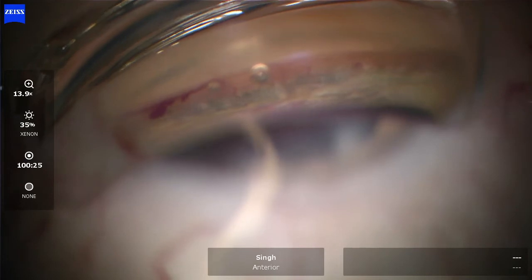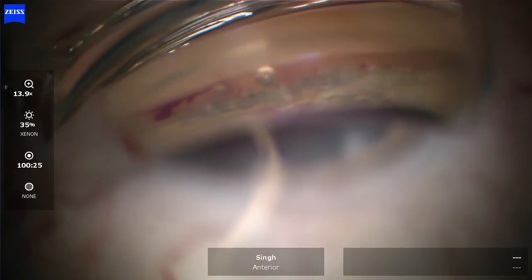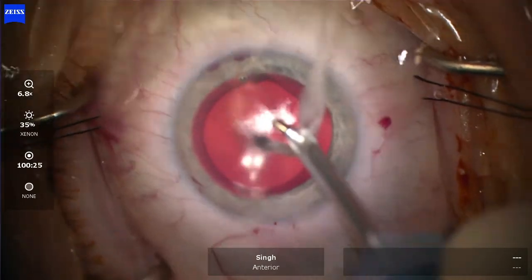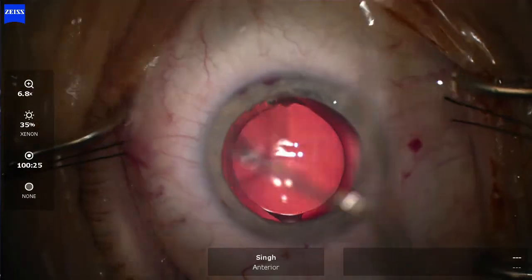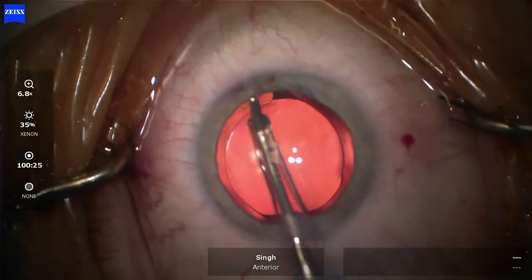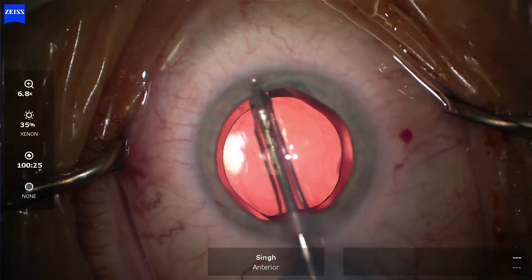This is really clear evidence that we are injecting a significant amount of viscoelastic and creating a nice microgoniotomy. At the end of the case you can see those two small areas where we did the microgoniotomies. I'm going to remove the viscoelastic now, and what's also notable is the evidence of blanching.